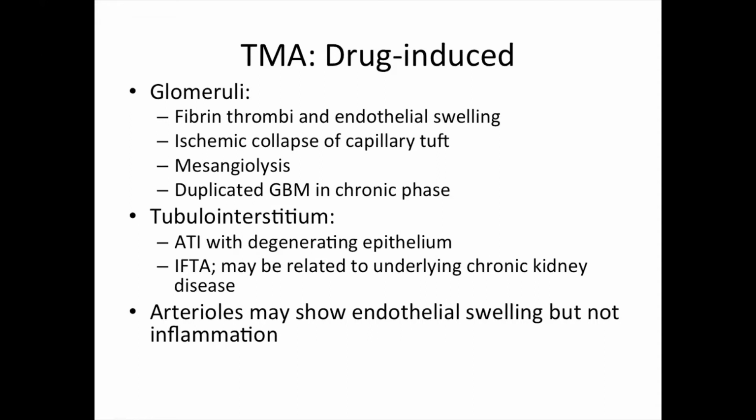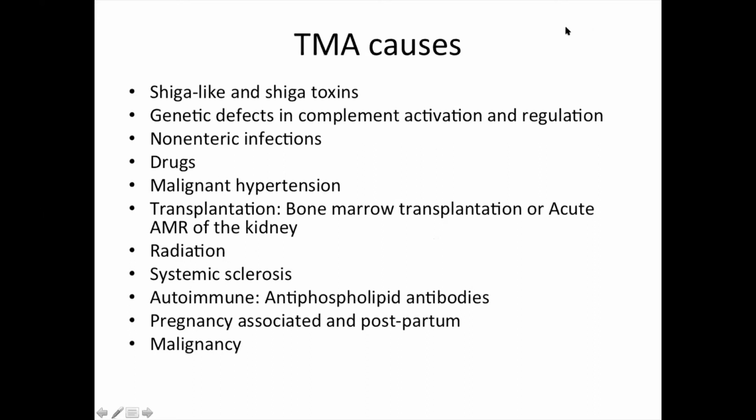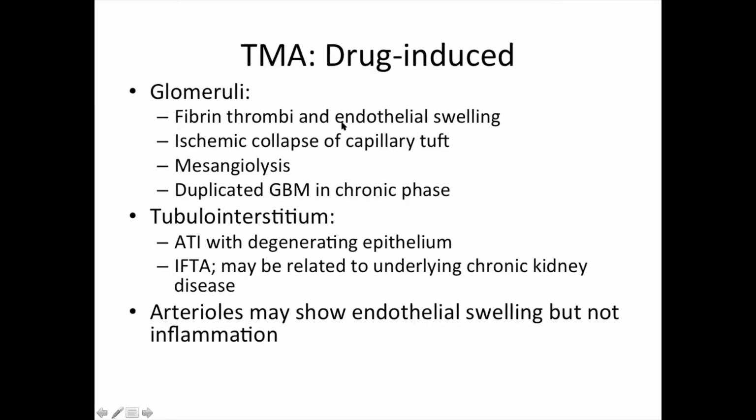And the arterioles can show endothelial swelling but we don't have inflammation. So it's not vasculitis, but we can have endothelial swelling. Generally, let's review TMA.